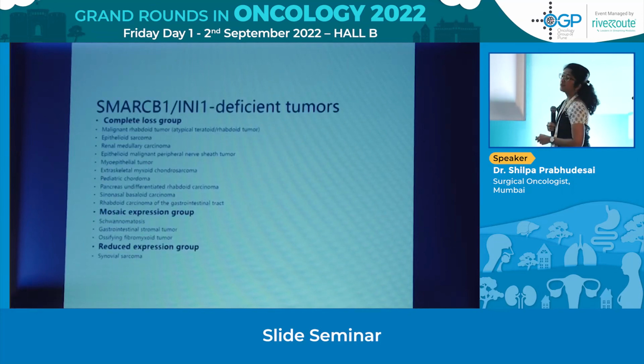So this is a list which is available everywhere. With INI1, the loss may not be complete. There may be a complete loss, there may be a mosaic expression and a reduced expression. So the case that I showed you, the sinonasal basaloid carcinoma, that is in the complete loss group, which we saw in the previous case. So this list is increasing day by day as more and more tumors are tested for this.